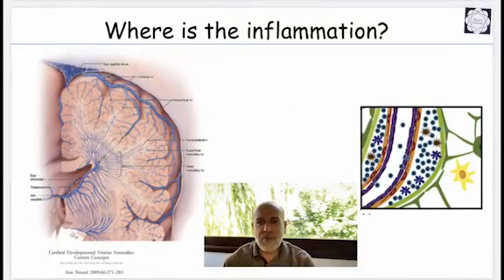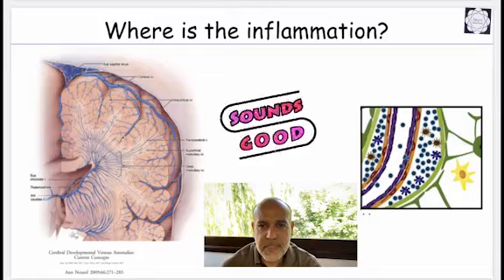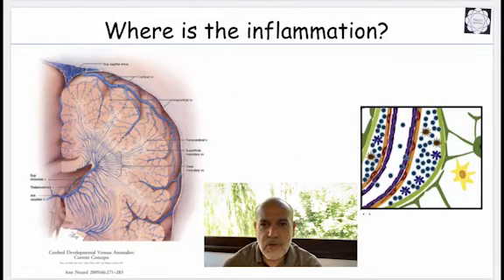So now that we know where our perivascular enhancement is, we have to understand the different patterns that we saw at the beginning of the talk. And to understand this, we have to know the venous anatomy. Here we have a very nice cartoon of the venous microcirculation.